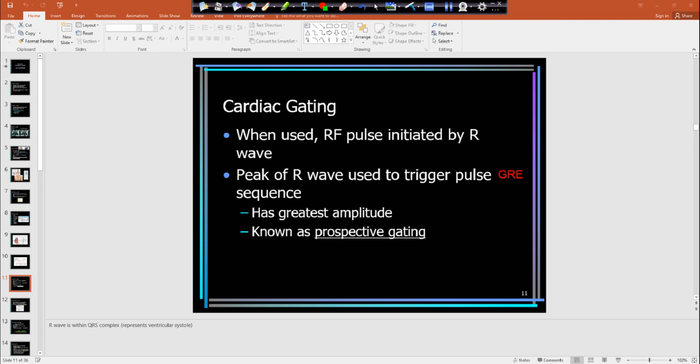If you have an athlete that is trained, like a marathoner, like a guy that ran under two hours for the marathon, what do you think his heart rate is? Is it below or higher than 100? Below. Usually those really good athletes have lower, kind of quieter heartbeats, and they're usually around 40 or 50. So we use that R wave because it has the greatest amplitude. So that's why it's a little troublesome when that T wave is elevated at a 3 Tesla magnet.